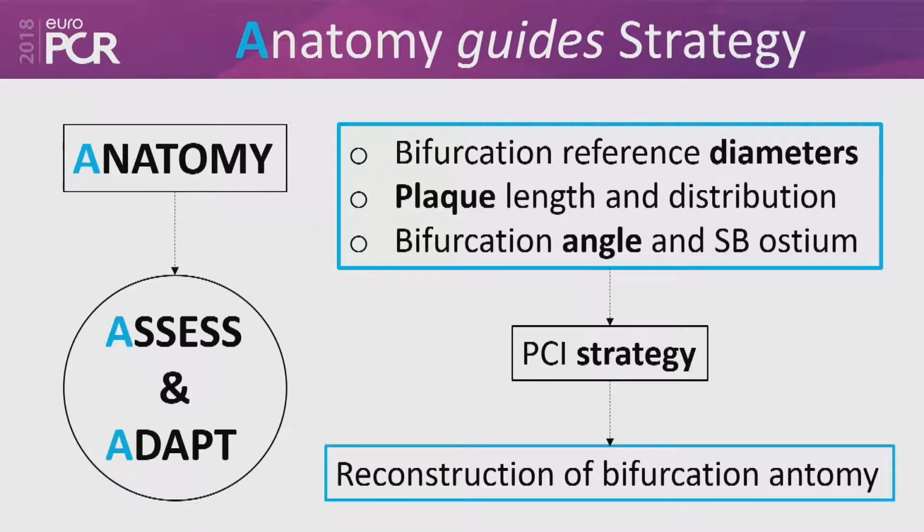And I think one more important point to this question: indeed, we like to say wire first, which requires more manipulation, because this is how you can avoid wire twisting. But in this anatomy, if you look, the major tortuosity comes in the LAD. So if you place a wire in the LAD, it straightens the LAD, it removes a lot of difficulty from wiring the side branch, as it happened here.